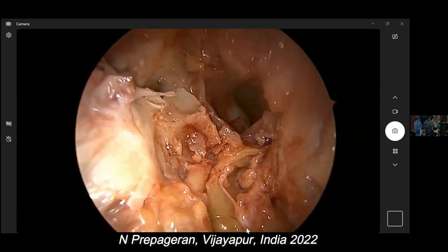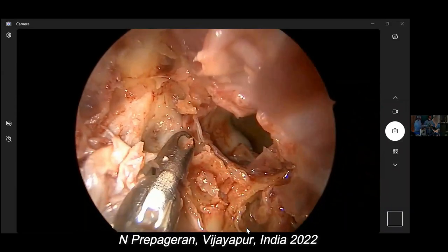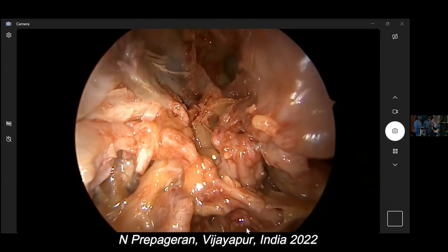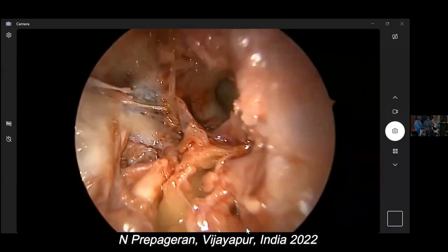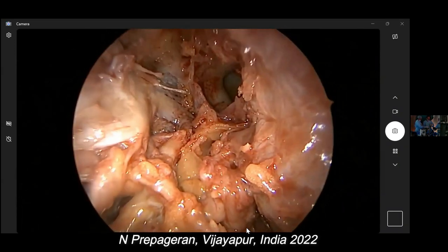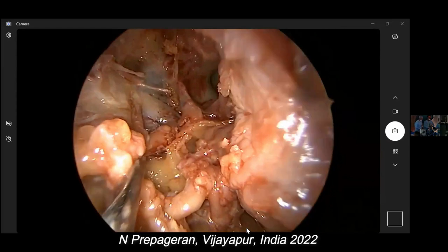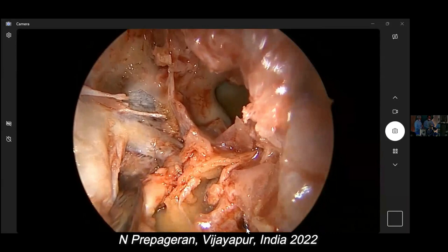Okay. So now let me remove this piece of bone. Always be careful. You can accidentally hit the scope. So always be careful. There. Beautiful. Please clap for Shashi for wonderful sculpturing. So now can you see that foramen rotundum? Clear? Yes. Maxillary strut. Clear? V1.